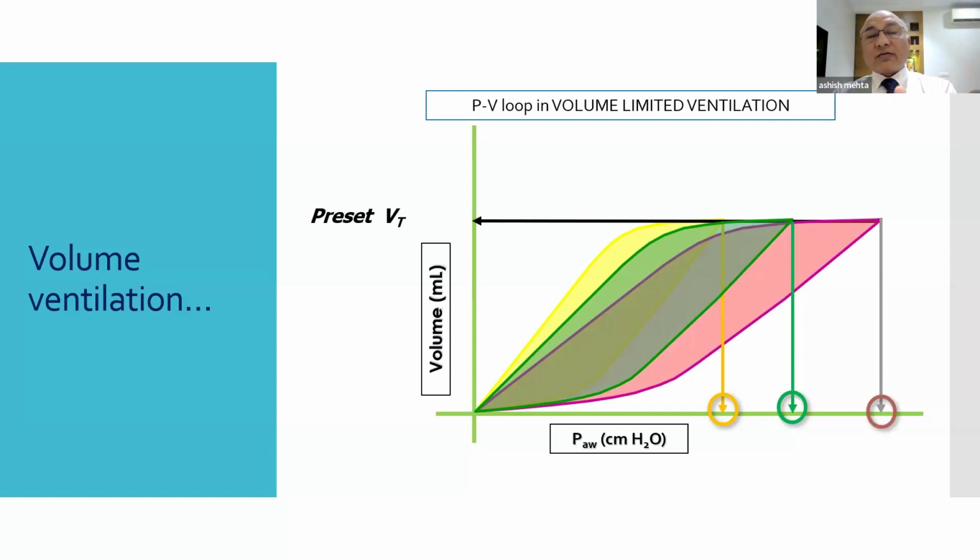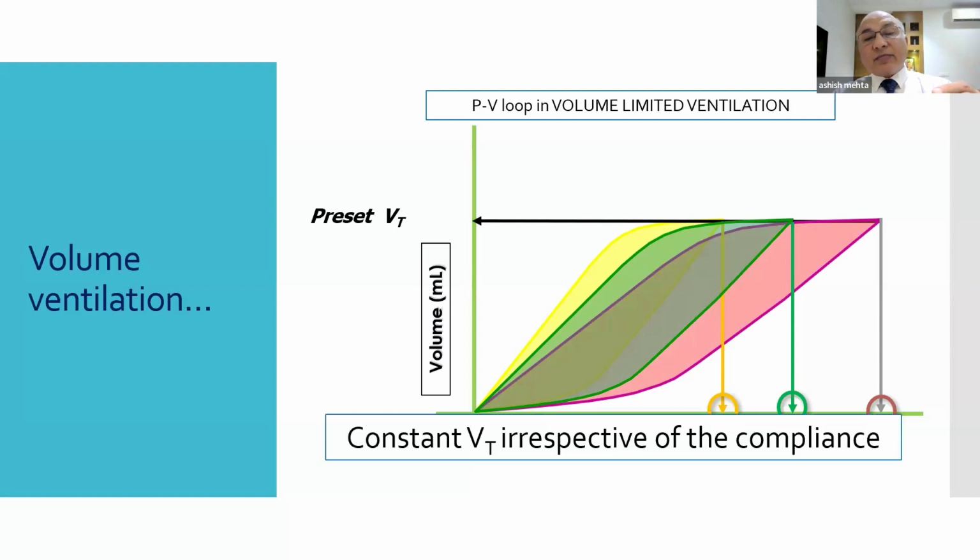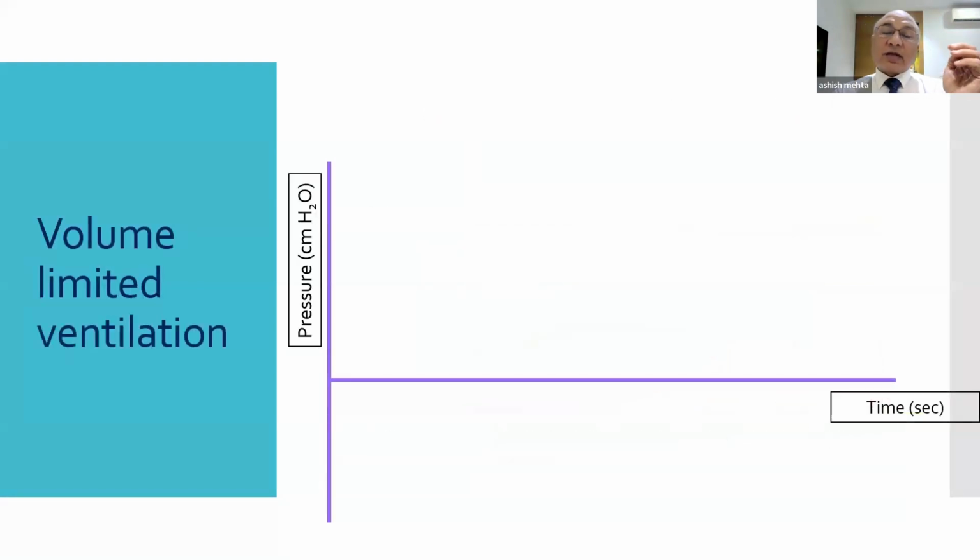So this is a fact that with volume ventilation, one can better control the volume, which will prevent volume trauma, and because the volume will control the pressure, barotrauma also can be looked into.